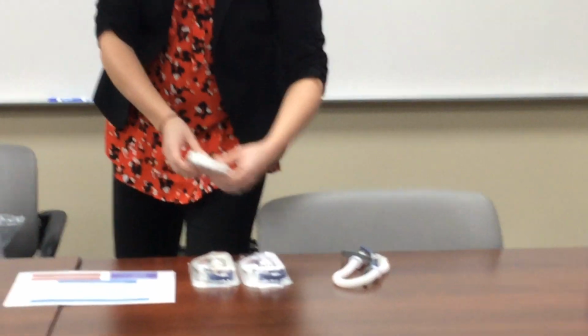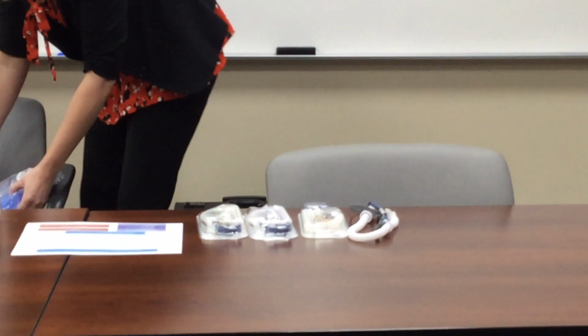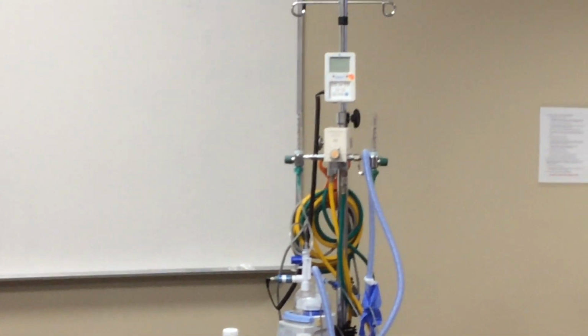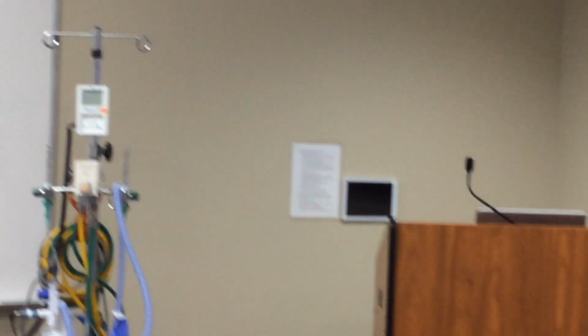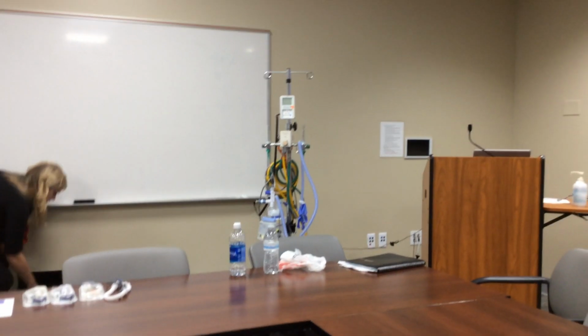So, as far as I understand, 6 liters was our maximum flow on the acute care floor, but is it changing to 8 now? It's been an 8 for a while. Oh, it has been 8. Yeah, you can look at the escalation side. But after 8, they transfer to PICU, right? Yes, yes. They don't stabilize on 8.